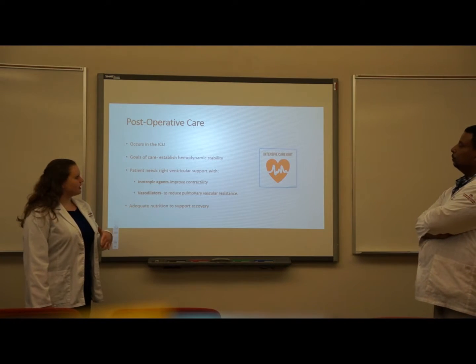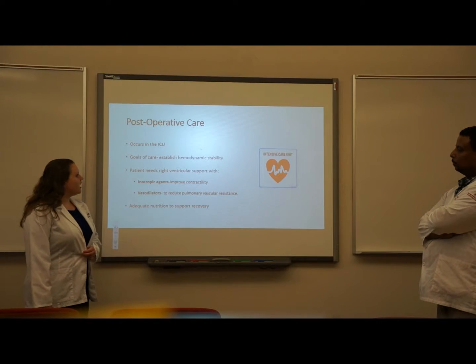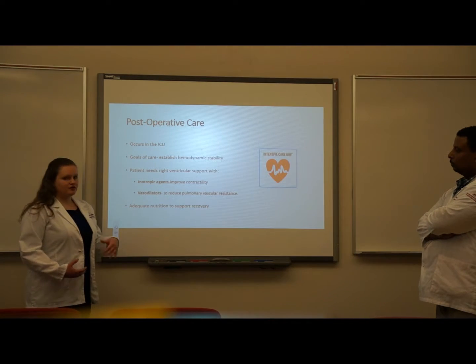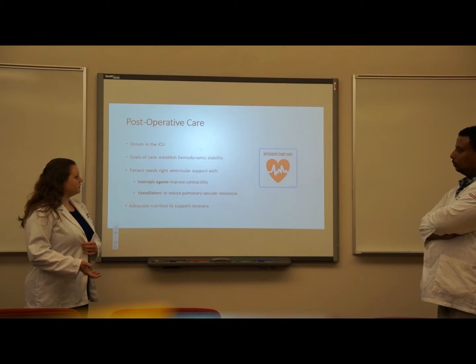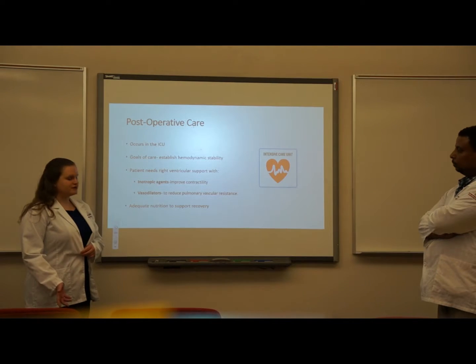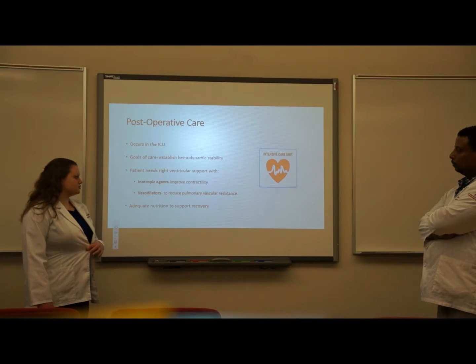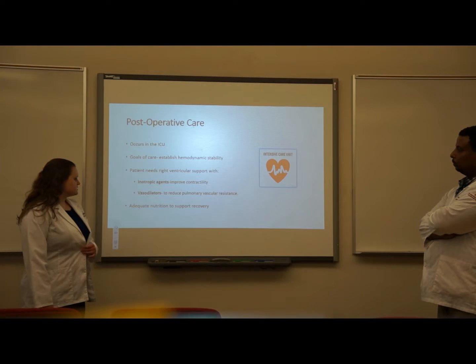The goals there are to establish hemodynamic stability. The patient will need right ventricular support now that the left ventricle is being supported by the pump. And that's through inotropic agents, which will improve contractility, and through vasodilators, which will reduce pulmonary vascular resistance.